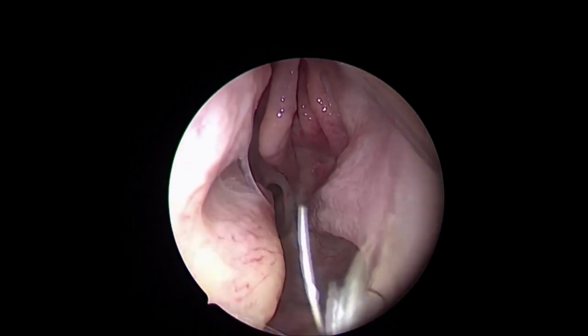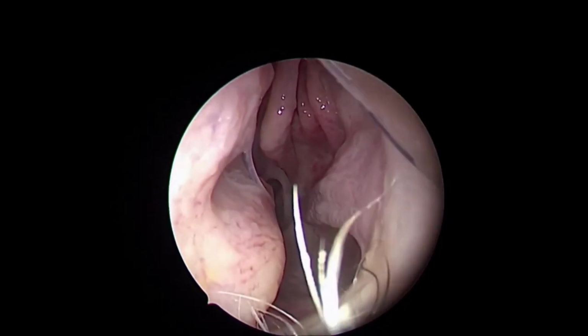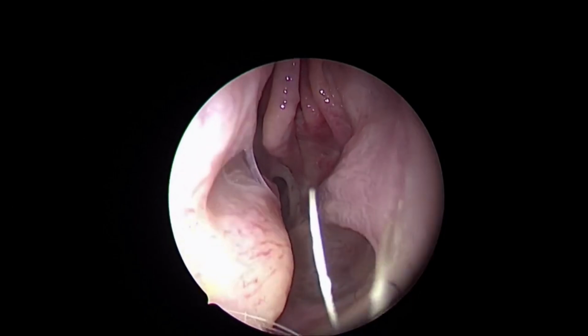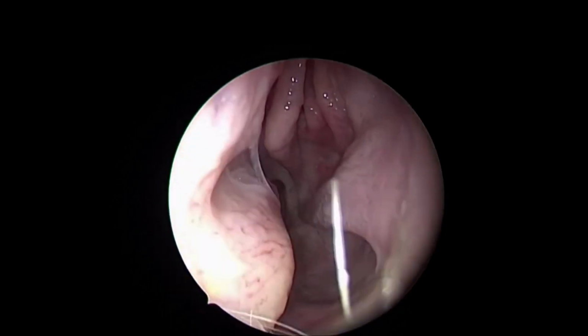surgery, there are so many flaps which have been introduced more and more now to reconstruct the skull base in different situations. So we'll be demonstrating all those flaps, intranasal as well as extranasal, which can be used for the reconstruction of the skull base in particular conditions.